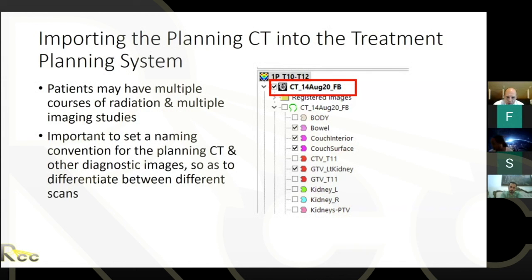And I told her I think it's important to be consistent in a clinic. Yeah, absolutely. Probably have some sort of set criteria that you always put in, right?